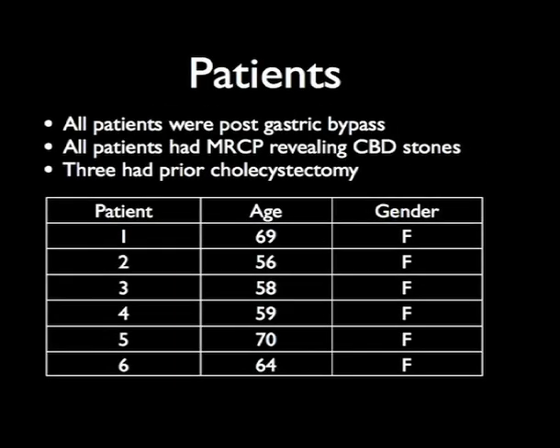We describe a novel technique of US-guided only access and removal of stones without need for retrograde access to the bile duct in a series of 6 patients with prior Roux-en-Y gastric bypass, referred for management of bile duct stones. All patients had positive MRCP studies for biliary stones.